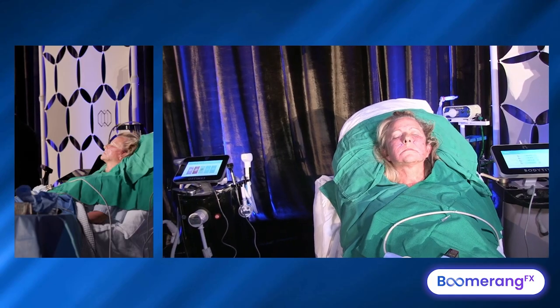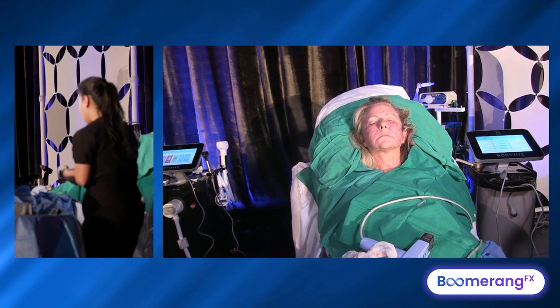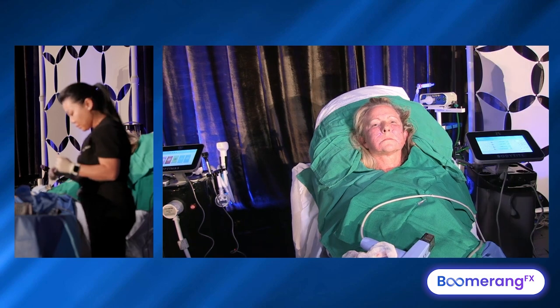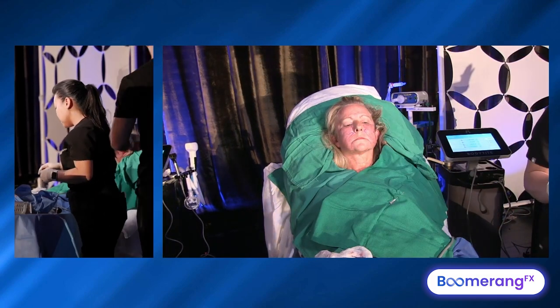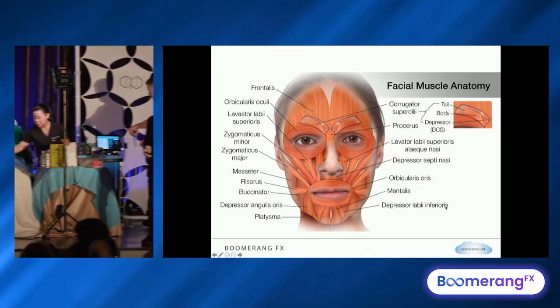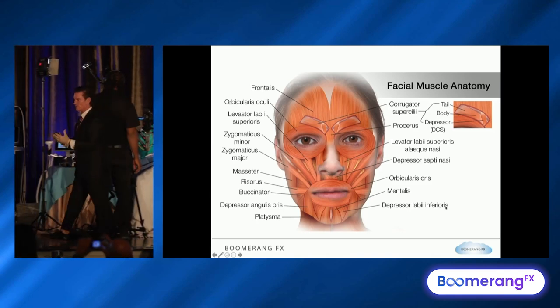We've done our injectable RF. I do heat first. The next thing I add is injectable neuromodulation. Remember this photo — memorize what it looks like statically and dynamically. I want to uncouple the elevators from the depressors.